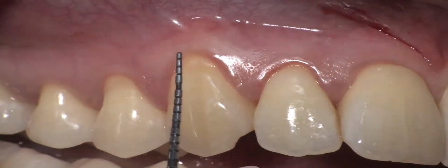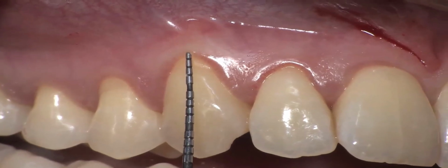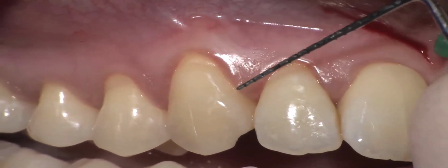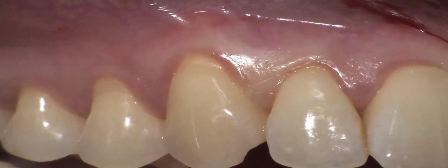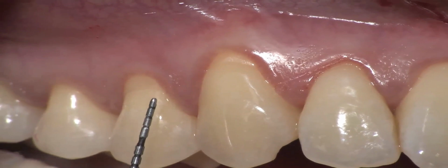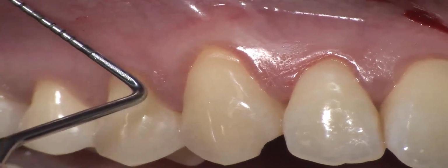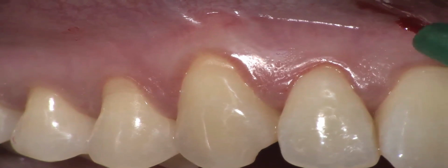We have to start at the level of the canine, 2 millimeters gingival recession. We have to add 1 millimeter, namely 3 millimeters, and we have to predetermine a point that will be followed by our knife in our incision. The same 3 millimeters, 2 millimeters plus 1, will be reported from the premolar to the canine.